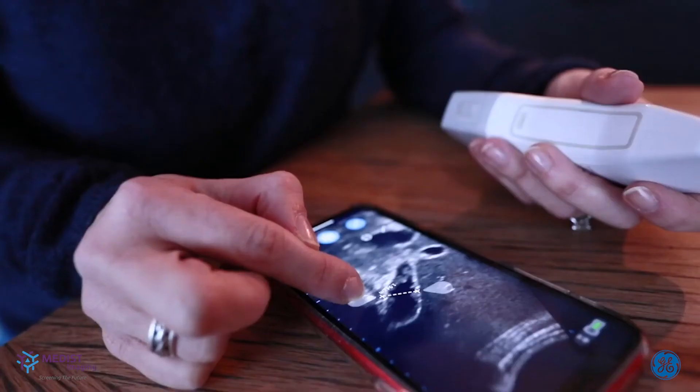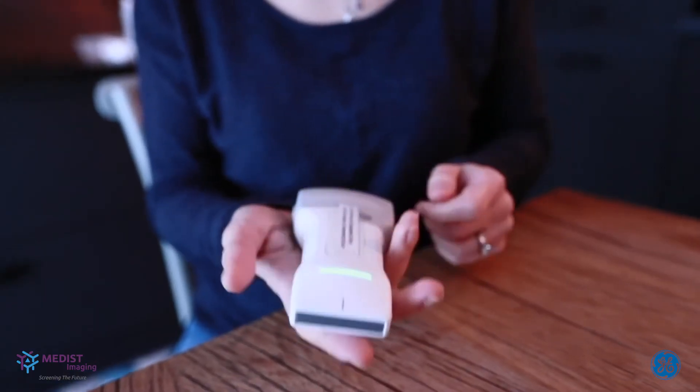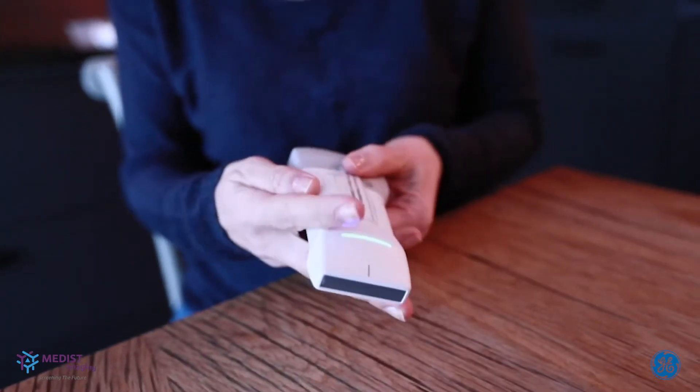The vScan Air — what's the plus? It's little. It's very practical. Image quality was very nice. I would definitely recommend the vScan Air. It has no cable in factory settings. It's optimal to clean. In the ICU setting, it's easy to use. It's light. It's handy. I would definitely recommend this portable device.